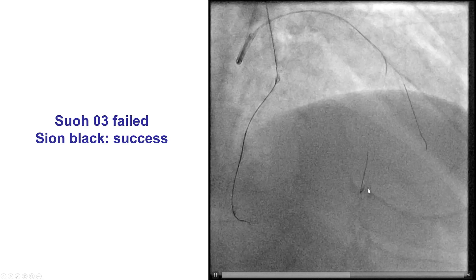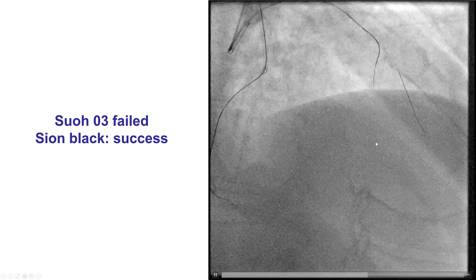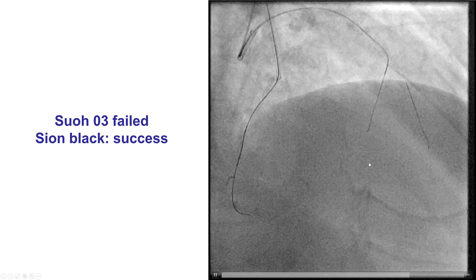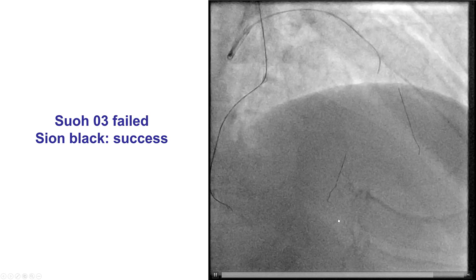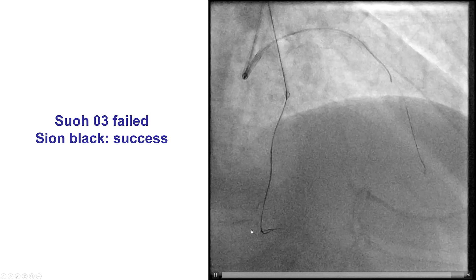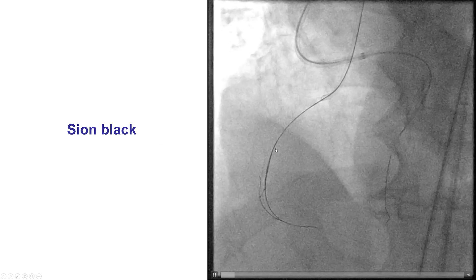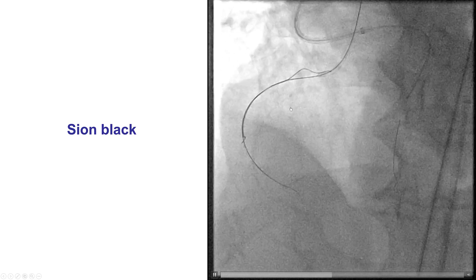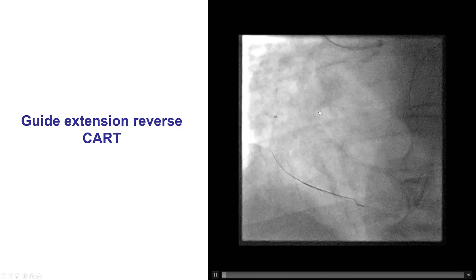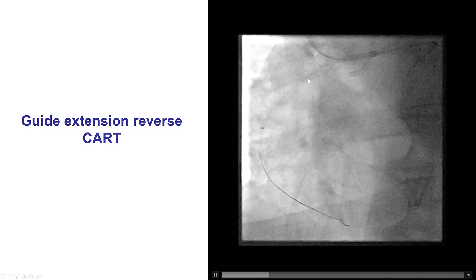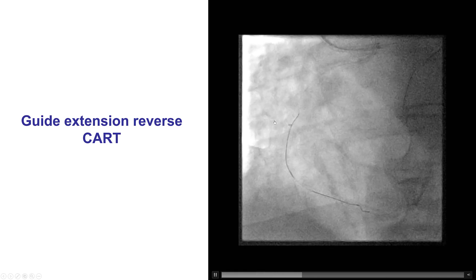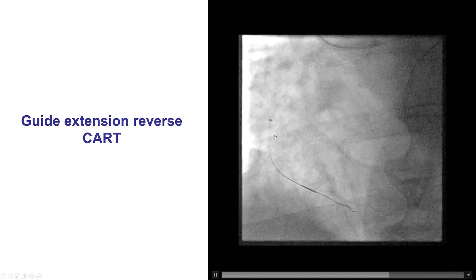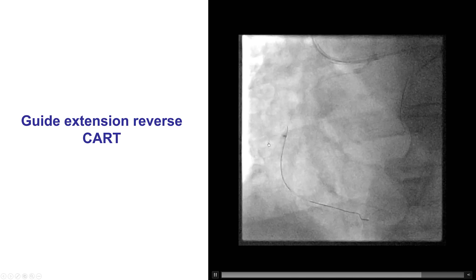Surfing was done. The wire followed several directions that were not appropriate initially, but then eventually, using a trial and error approach, the wire found its way through the septal collaterals and advanced distally into the course of the right coronary artery. The wire advanced more proximally and we initially made an attempt to get it into the antegrade guide catheter, but it looked like it was causing the subintimal space again. So eventually we used a guide extension reverse CART. This is a six French guide extension, and then after ballooning the mid-RCA, we were able to advance the retrograde SION black guide wire into the antegrade guide extension.